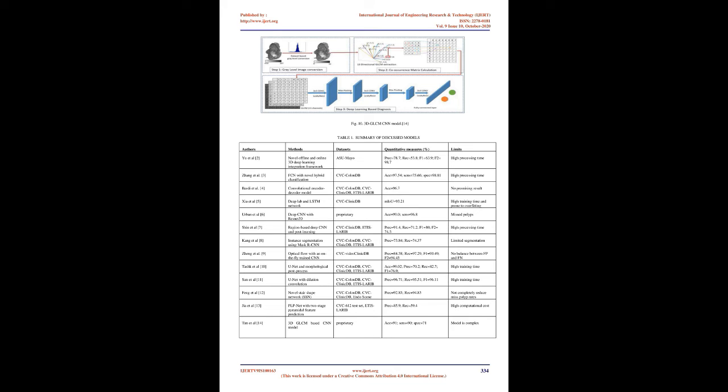The learning process would be complicated by the complex colonic wall if pixel-wise training is performed directly on the CNN model. Therefore, a two-stage framework is proposed, where the polyp proposal stage is constructed as a region-level polyp detector, aiming to accurately segment the area that the polyp occupies in the image. In addition to this, the very deep ResNet 50 as well as a pyramid component are applied to seek deeper and richer semantics from each frame. Feature sharing and skip schemes are adopted to perform multi-scale transfer learning between stage 1 and stage 2. The overview of PLPNet is shown in Fig. 9.